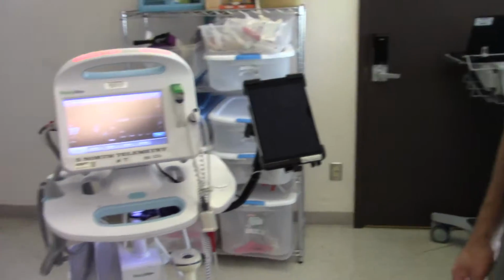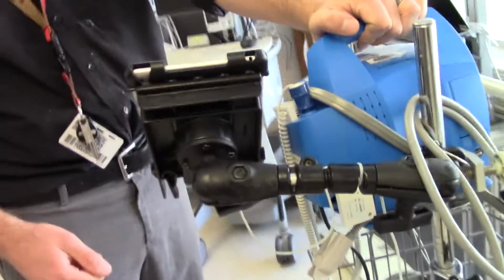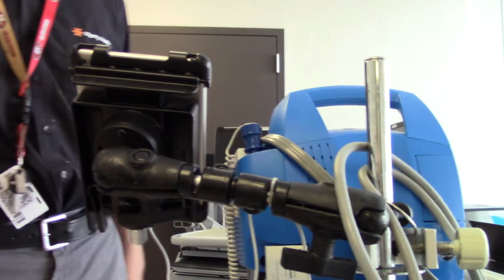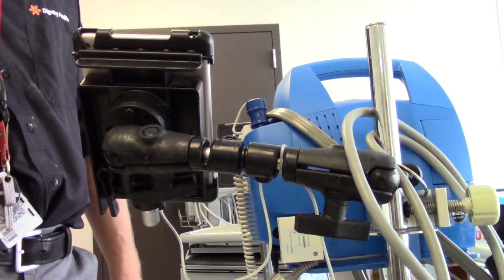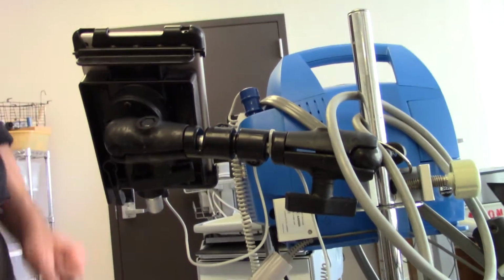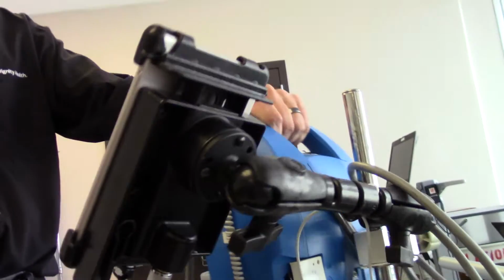Okay, great. All right, so what do you want to tell me? Now, this is put together a little different. With the Dinamaps we see a lot fewer issues because the arm is a lot shorter and it's straight across here, so there's not as much flexibility, as when it's sitting out on the end of a big lever. This is put together with the same two shoulder mounts, but the connection rod, which is the same material, is just a lot shorter, about an inch. So you don't get the wobbling. Correct. It's a lot less prone to being injured and whipped around because it's not moving. It's a lot more stable.